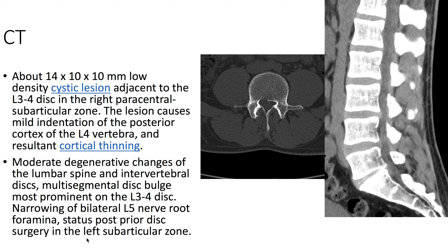On CT, we see a low-density cystic lesion adjacent to the L3-L4 disc in the right paracentral subarticular zone. The lesion causes mild indentation of the posterior cortex of the L4 vertebra.